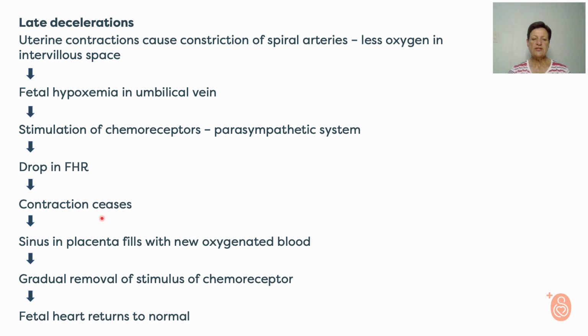And then as soon as the contraction is over, all these messages need to go again to the chemoreceptors and recover this whole deceleration. So the fetal heart only returns to normal after the contraction has already gone.